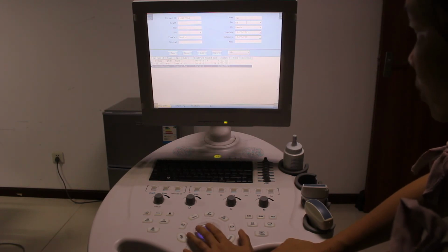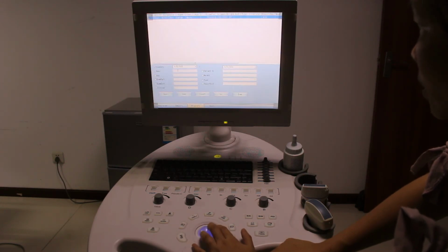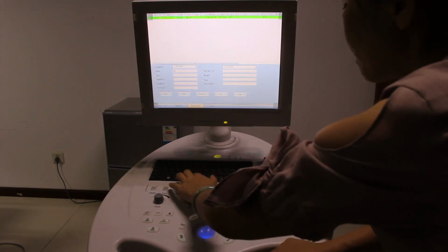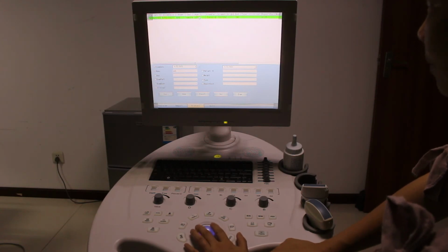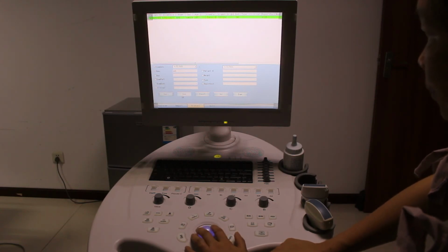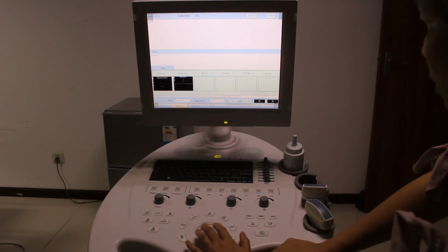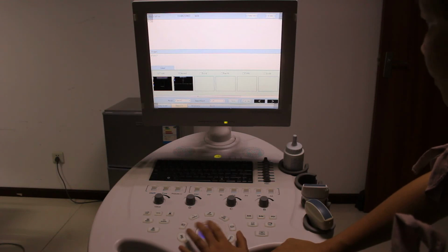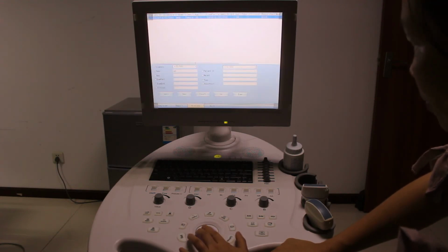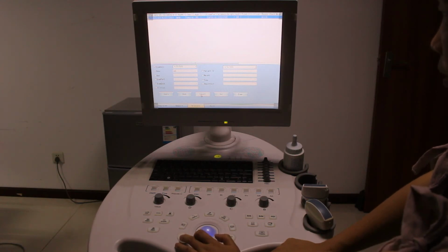We go to history, and we write MNB, and we press query. Then you see this MNB is out. And we want to see the report. Open it. This is the report and review the report out. Go to history. This is report open. And maybe we want to save the report, then export the report to the computer.